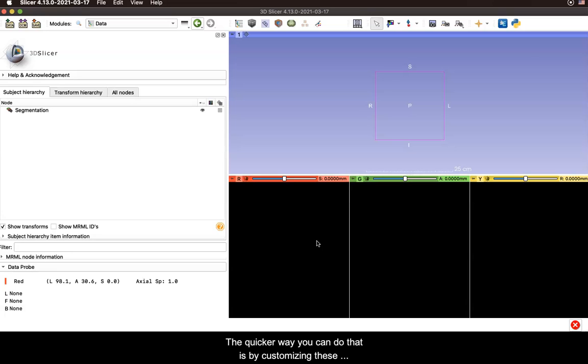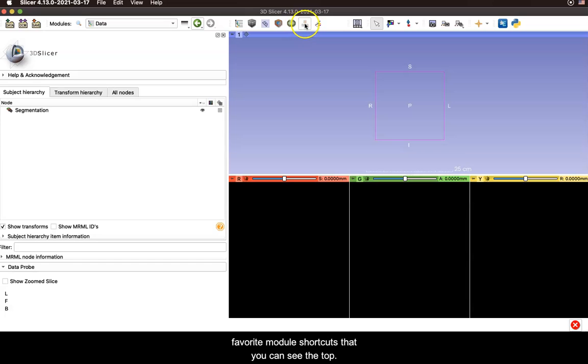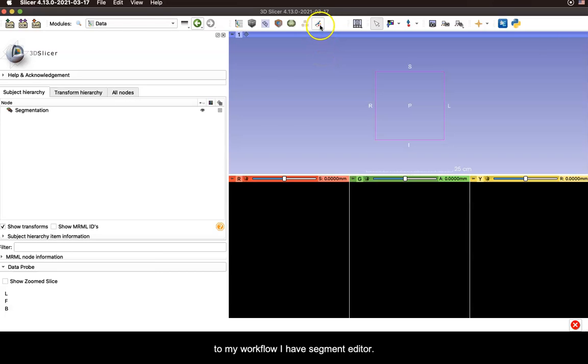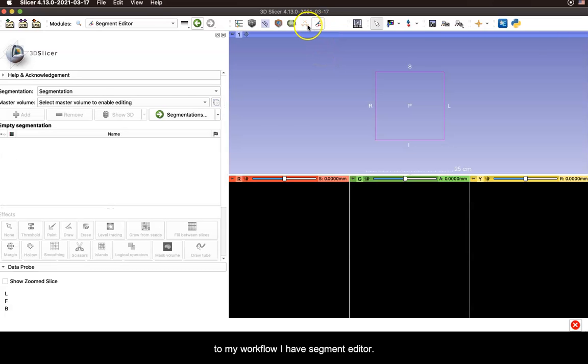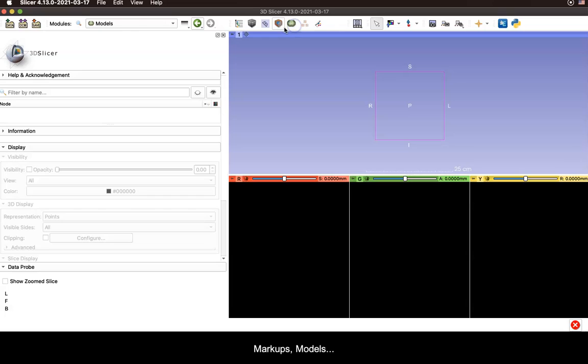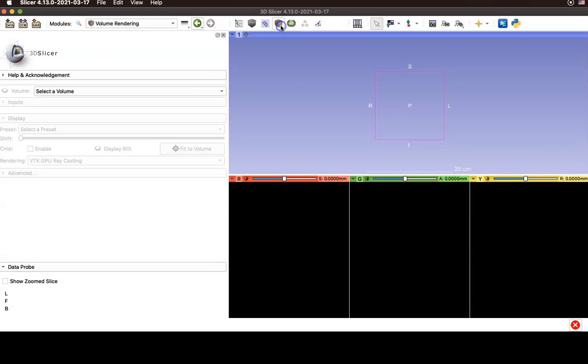But a quicker way you can do that is by customizing these favorite modules shortcuts that you can see at the top. So I've customized this for the modules that are most helpful to my workflow. I have segment editor, markups, modules, volume rendering, and so on.